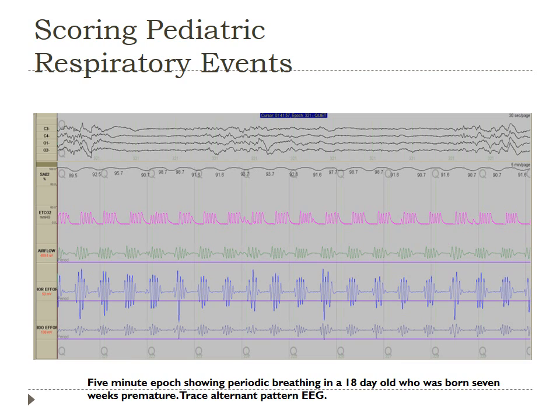Here is a five-minute epoch showing periodic breathing in an 18-day-old born seven weeks premature — the same slide we looked at with the trace alternant — but this would actually be scored as periodic breathing.